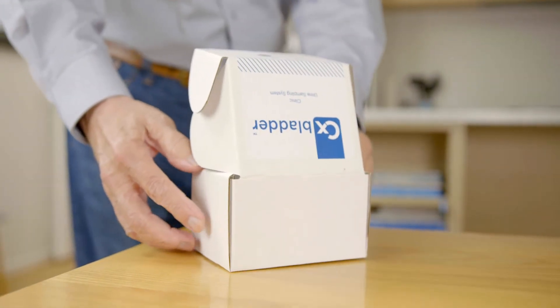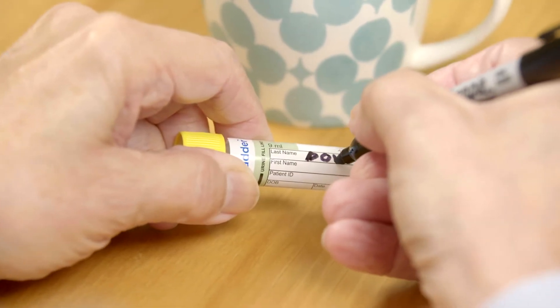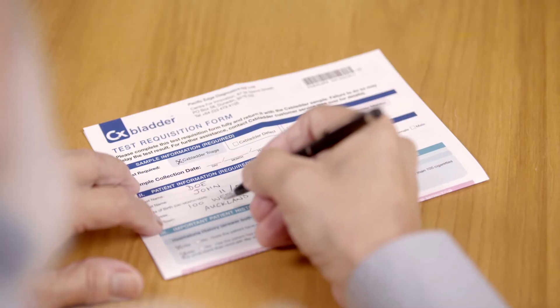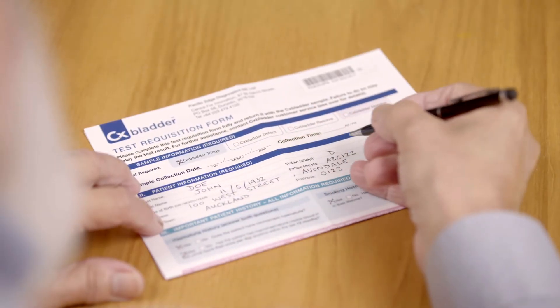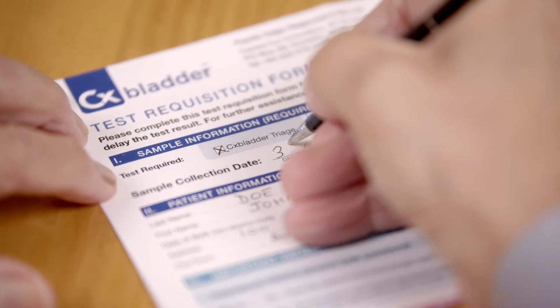Before beginning the CX Bladder sample collection process, please set the box aside to help store your sample following collection, and label the test tube with the name and date of birth of the patient along with the date the sample is collected. Please then check that the test requisition form contains the correct information and record the date of the sample collection.